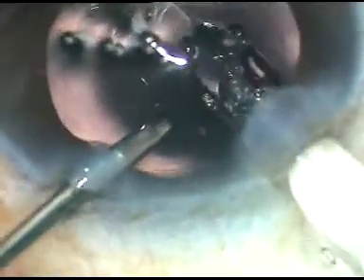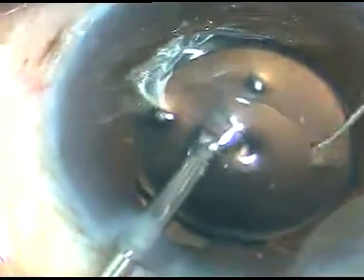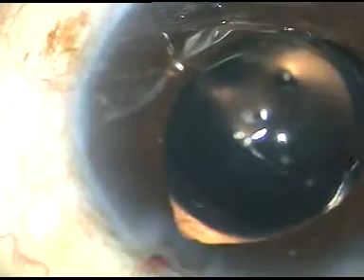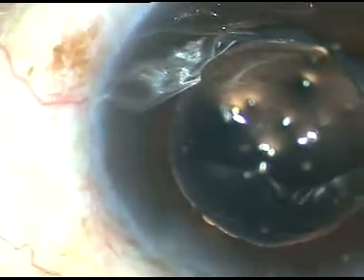Now a hydrophilic acrylic intraocular lens is being implanted. The leading haptic has gone into the capsular bag and the trailing haptic is being dialed with a Sinskey hook, going into the capsular bag. Both irises tend to prolapse to the incisions, indicating a mild form of floppy iris syndrome in this case. The iris is reposited. Now the side ports are hydrated so that these wounds become watertight.